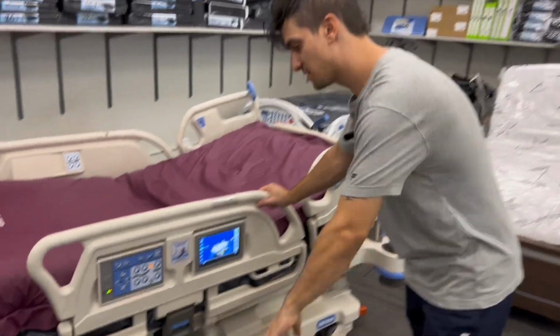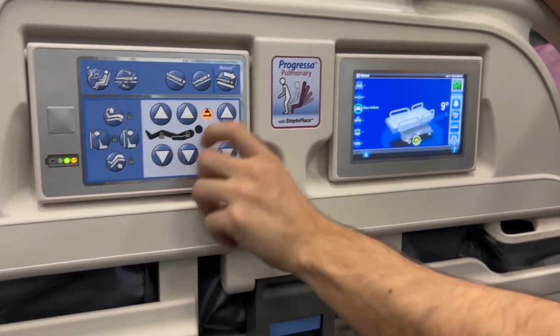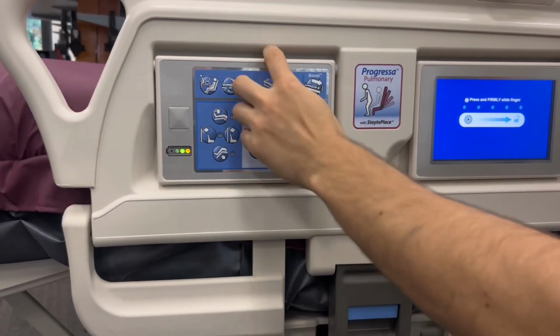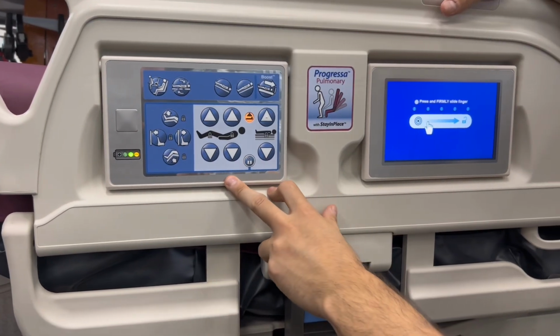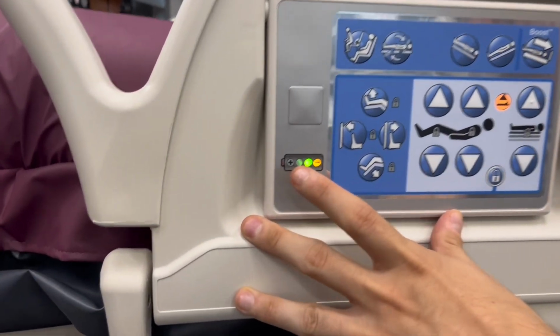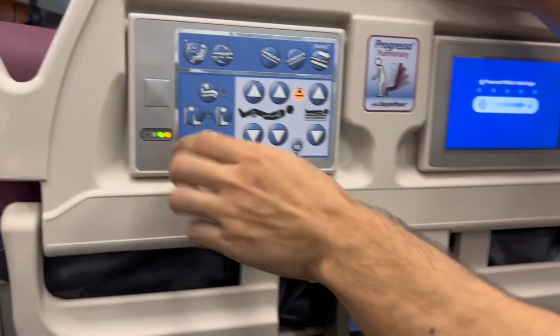So now jumping into some of the more intuitive functions of the bed frame itself. Here we're going to have two separate tablets. One's going to be a digital one with the screen. The other one is going to be our general controller for the bed frame. So we'll start with the general controller. The first thing on the left side we're going to have is our battery backup and our battery life. This does have a battery backup just in case there's a power outage, so you can operate the bed.